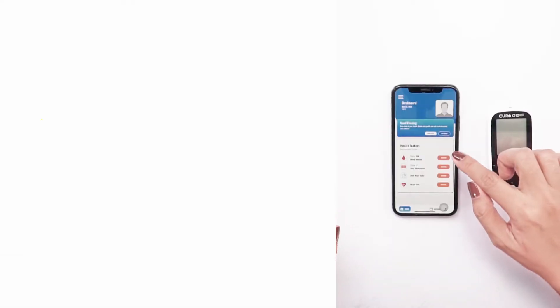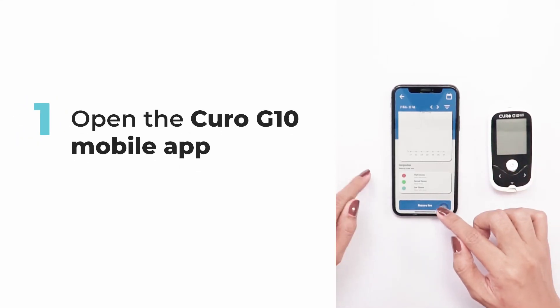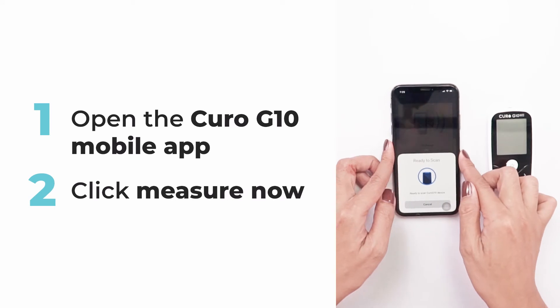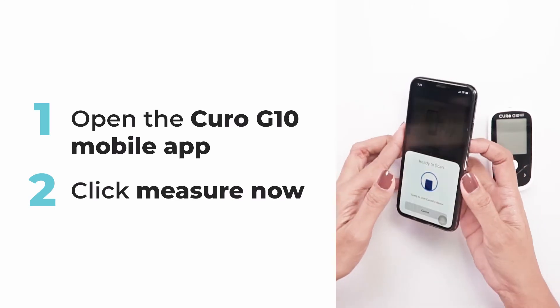The Curo mobile app is a mobile application software designed to assist you in your health journey. Using the Curo G10 mobile app, you can track your glucose level results by using the NFC function. All you need to do is open the Curo G10 mobile app, click 'Measure Now,' and get ready to scan your device to start pairing. You can scan the device without the need to open it.